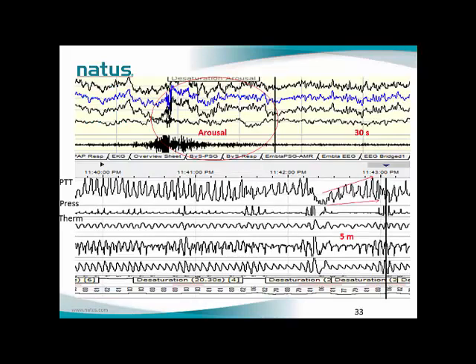In this example, we have the neurotraces that are displayed over 30 seconds, while respiratory traces are displayed at 5 minutes. The black bar is called the indication bar, and it is used to synchronize the time between the two worksheets. The indication bar is preceded by an obstructive hypopnea that is associated with an EEG arousal.